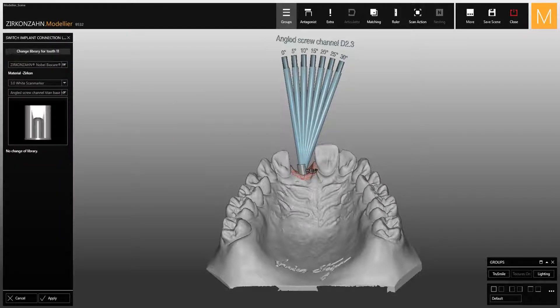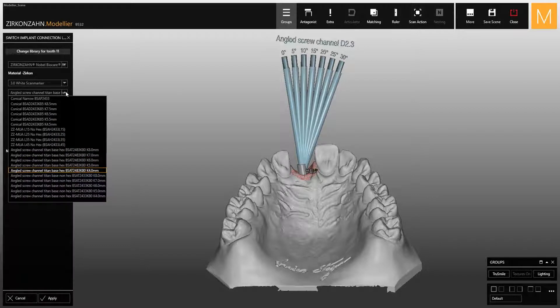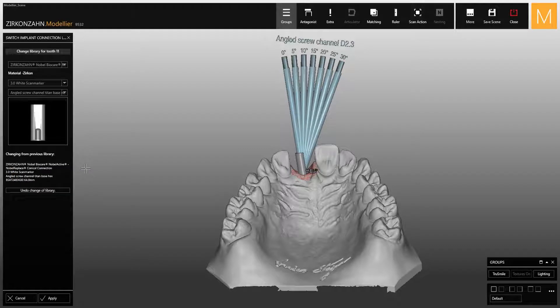Select the function to change the implant connection. Once the function is activated, you can see which type of library has been selected, the scan body type and the corresponding implant component. If a different height is required, in this menu you can change the type of titanium base.